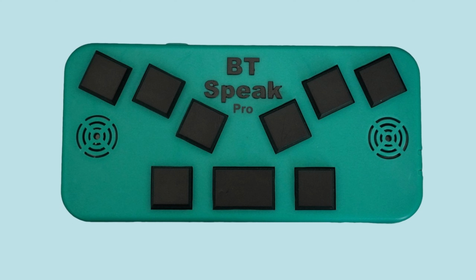Yeah. So one of the variables for the quality of the voice recorder is the microphone volume. The microphone volume could be at a level that's not very optimal. We recommend something like 70, 75% to get reasonably good results. The recording quality is modest. It's not high fidelity, but very functional for capturing someone's phone number or some notes. But the device is more focused on actual entry of content, and the recording is sort of a value add rather than the central feature of the BT Braille and the BT Speak.